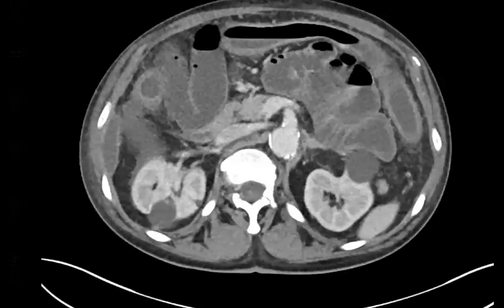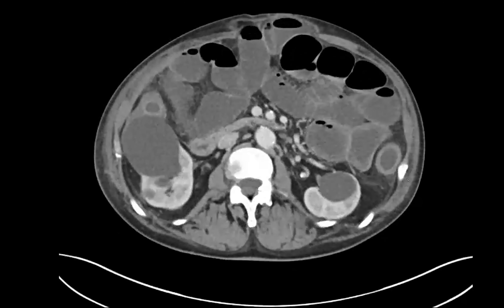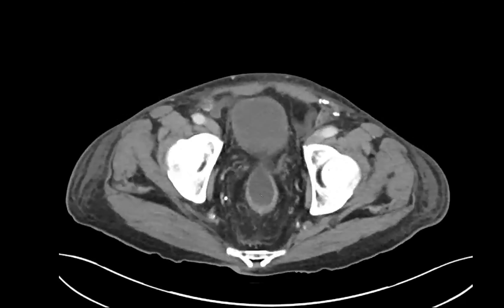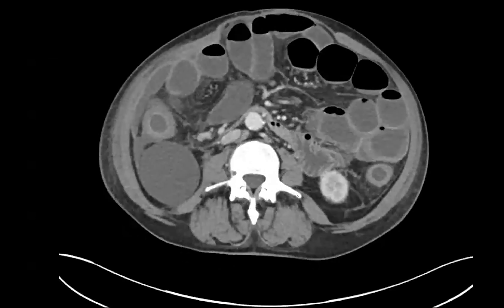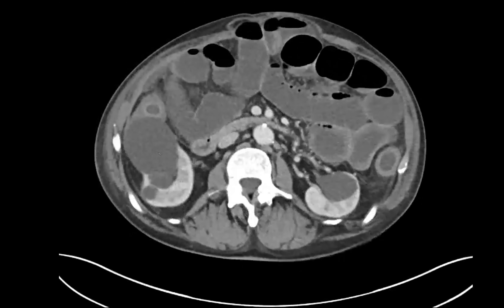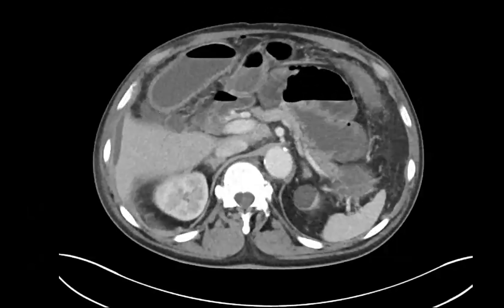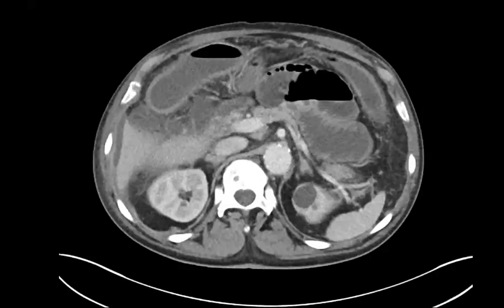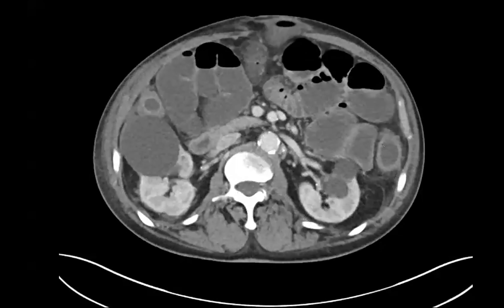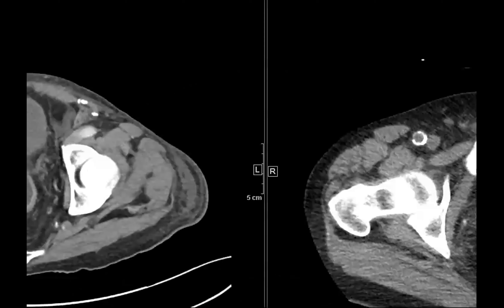Another interesting case: looking at this patient's colon. Starting inferiorly, the rectum and sigmoid are thickened, and the transverse colon has a haustra-like appearance — this looks like ulcerative colitis. The colon has hyperemia of surrounding vessels and wall thickening and inflammation. The patient does have a history of ulcerative colitis. Comparing to an exam six months ago, the colon was less thickened — the haustral pattern was still visible but the wall was much less thick, and everything has gotten significantly worse.